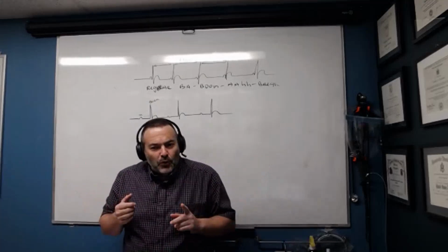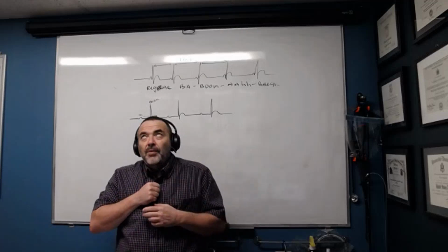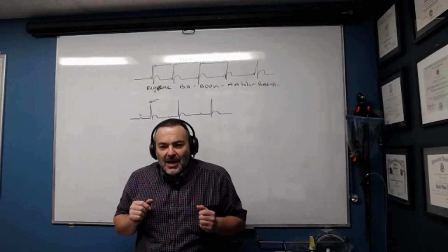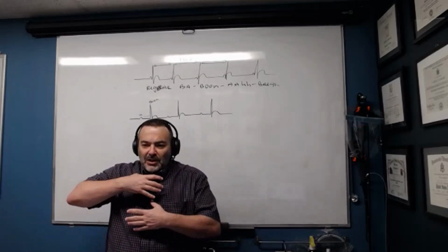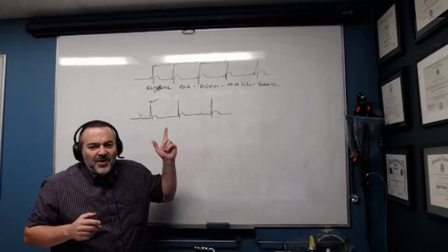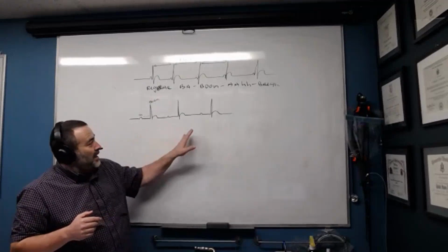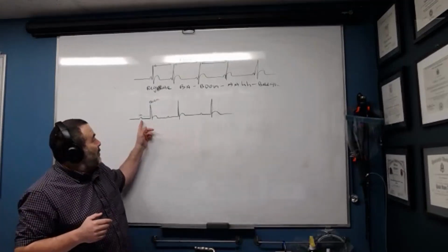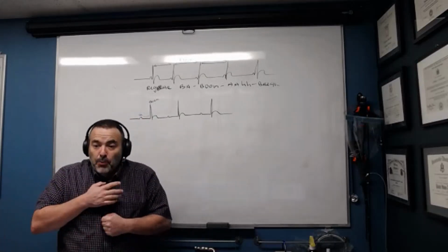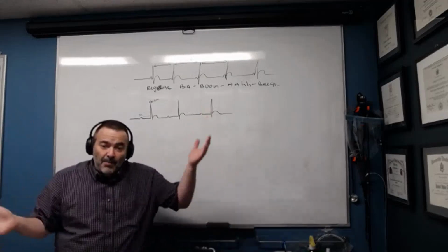Seems abnormal. It's supposed to be ba boom, ah, ba boom, ah. But this is ba, boom. There's a delay. What's happening? There's a delay between the squeezing of the top and the squeezing of the bottom. So now, visually and instinctively, as you sing this out, you begin to understand that there is a delay between the ba and the boom. Ba, what's ba? Top section of the heart squeezing. Boom is the bottom, and they're supposed to follow one another like a seesaw. Up, down, up, down.